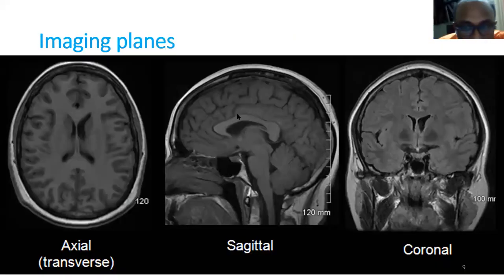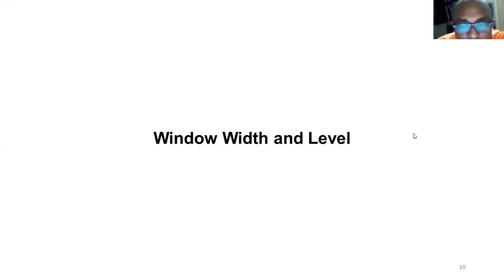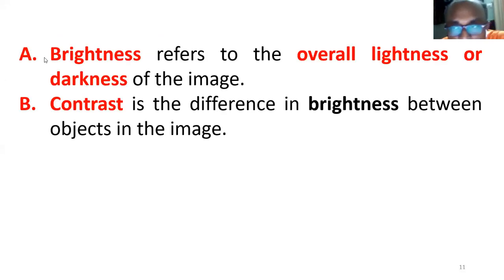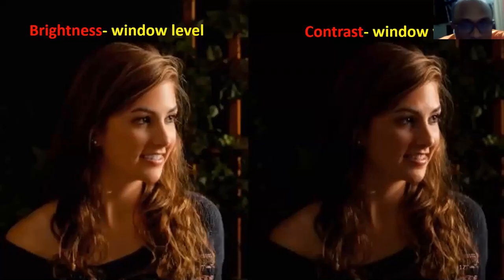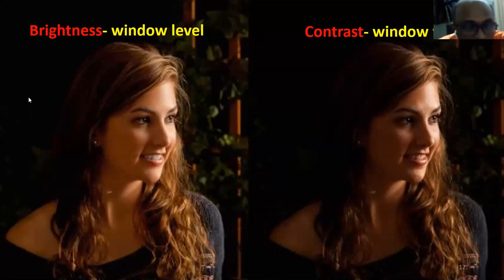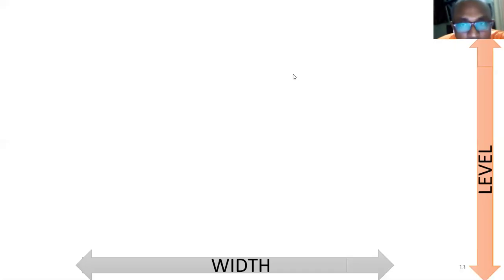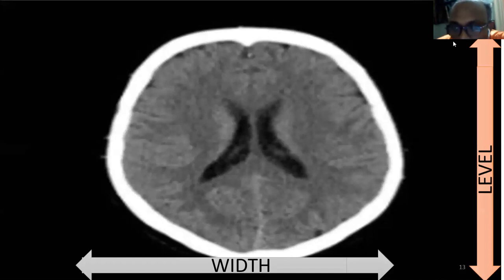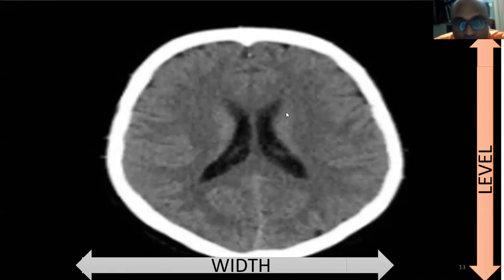Axial is side to side, sagittal is anterior-posterior, and coronal is the frontal view. Regarding window width and window level: brightness refers to the overall lightness or darkness of an image. Brightness is known as the level, and contrast is known as the width. If you change the brightness, the whole image changes. If you change the contrast, only specific parts within the image change. To adjust: drag the mouse vertically to change the window level or brightness; drag horizontally to change the width or contrast; drag diagonally to change both.